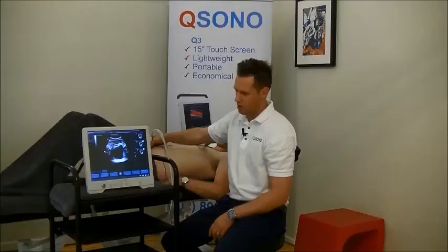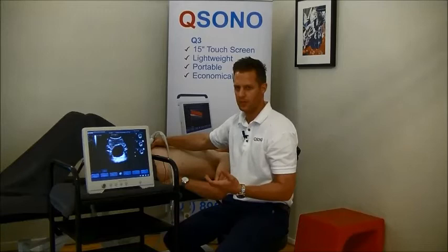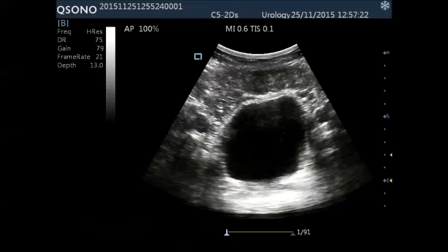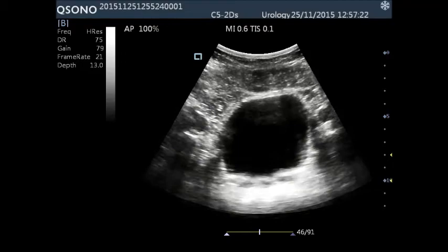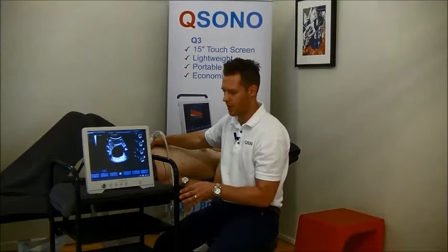We're also interested to see, of course, what happens when the patient does an active pelvic floor contraction. So assuming that we've just gone through and explained what that looks like for the patient, let's have a look and see what an active pelvic floor muscle contraction is going to look like whenever you're ready. Okay. So there you can see a nice elevation in the bladder base.